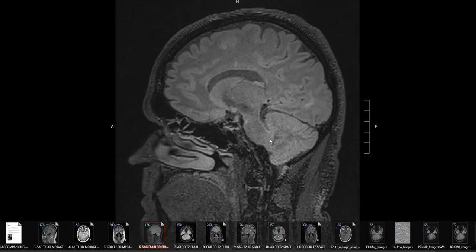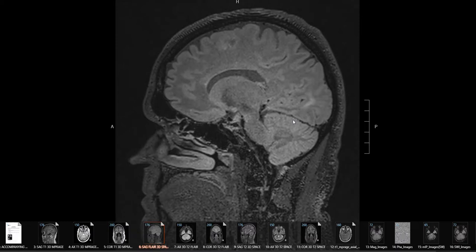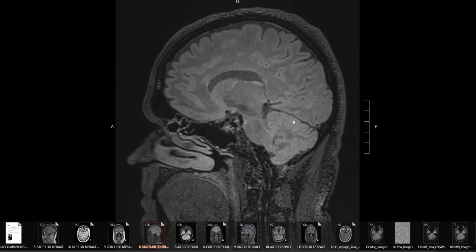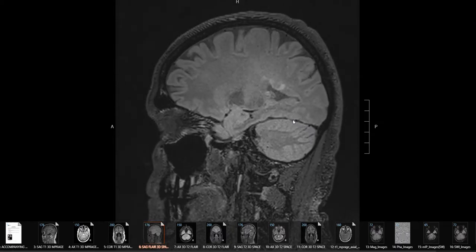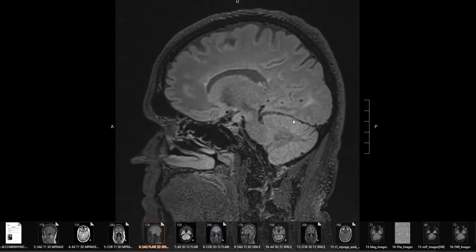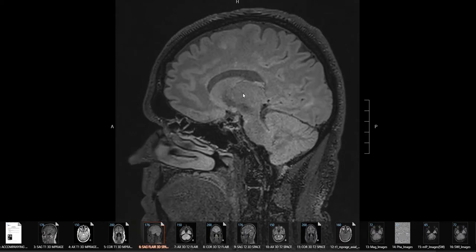Here we have what we call a FLAIR image that's sagittal — here is the nose, here is the back of the head. On these sequences, the multiple sclerosis plaques can be seen fairly obviously. Starting in the middle and moving to either side, you'll see some classic examples. Here is one: a bright, perpendicularly oriented plaque.